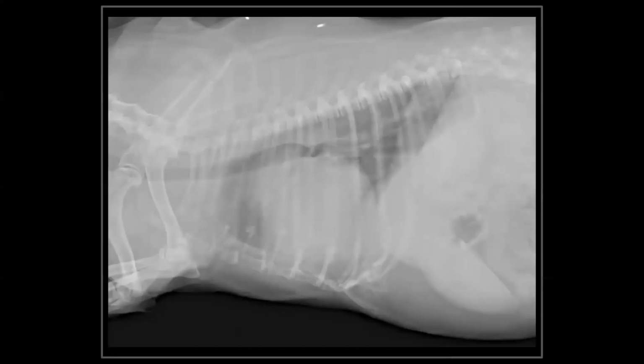So let's look at a couple of films. This is a patient. I would imagine that it looks like it's got a large heart as well. His VHS is likely to be enlarged. However, if you look at the dorsal portions of the lungs, where we normally look for the pulmonary vasculature, you can't really see the pulmonary vasculature. So I would say, yes, this would be a positive for bronchointerstitial infiltrate. You cannot find those pulmonary vessels.